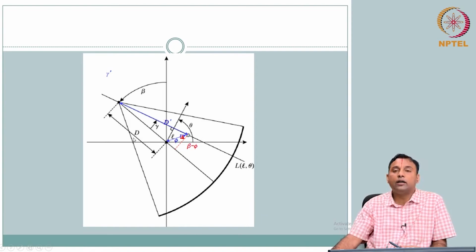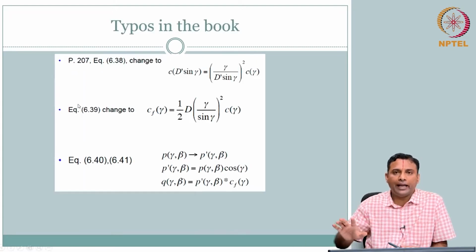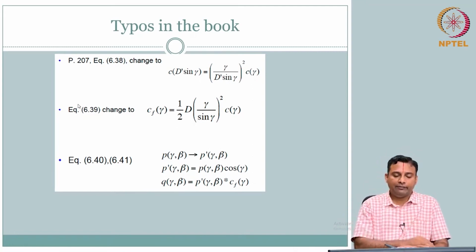So you do this geometric transformation of the variables in your back projection. Some of the steps are actually given in the textbook. You might find the reference textbooks also have these derivations. Essentially, it is substituting back into your formulation. We are not going to derive that, as it is a little beyond the scope of what we want to cover at an introduction level.